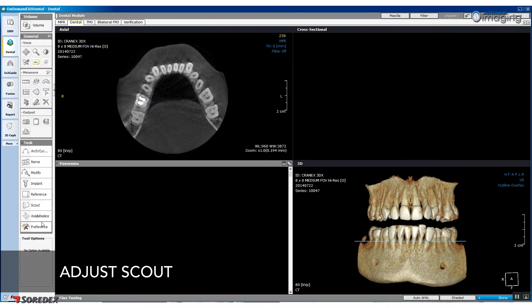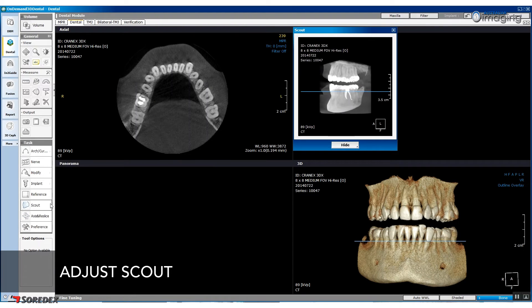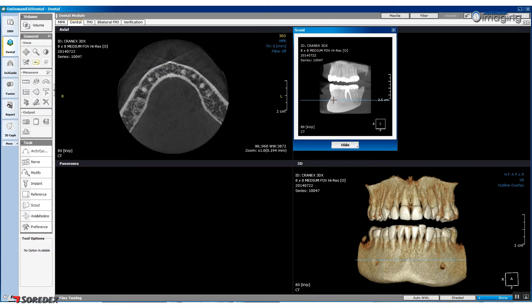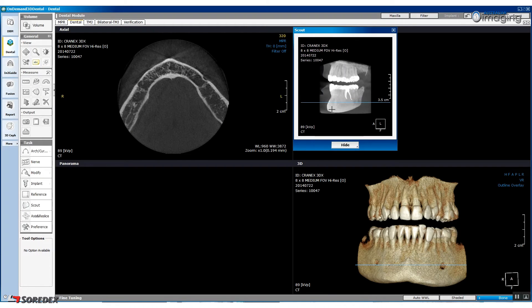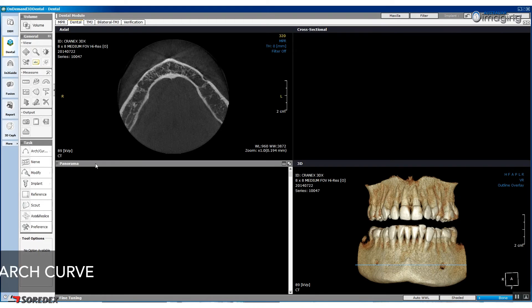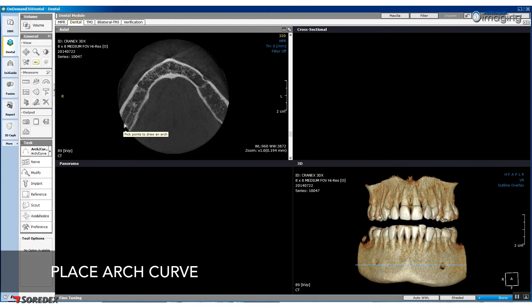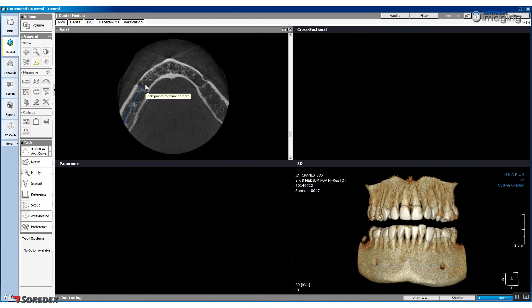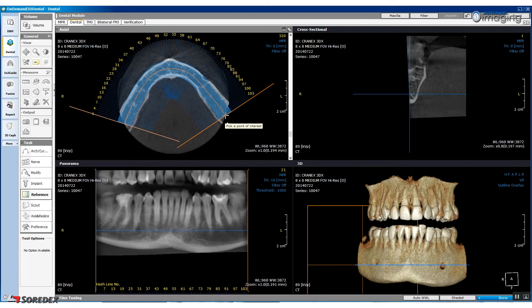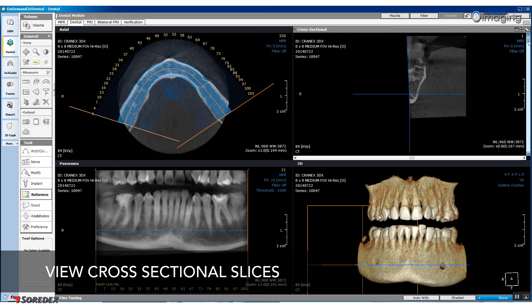Click on the Scout button under the task heading. Ensure that the horizontal plane is in line with the mental foramen. Once you are happy with the position, you are ready to place the arch curve. Click the arch curve button under the task heading in the axial panel. Click along the curve in small increments and double click at the end of the curve. Cross-sectional slices can now be viewed in the cross-sectional panel.